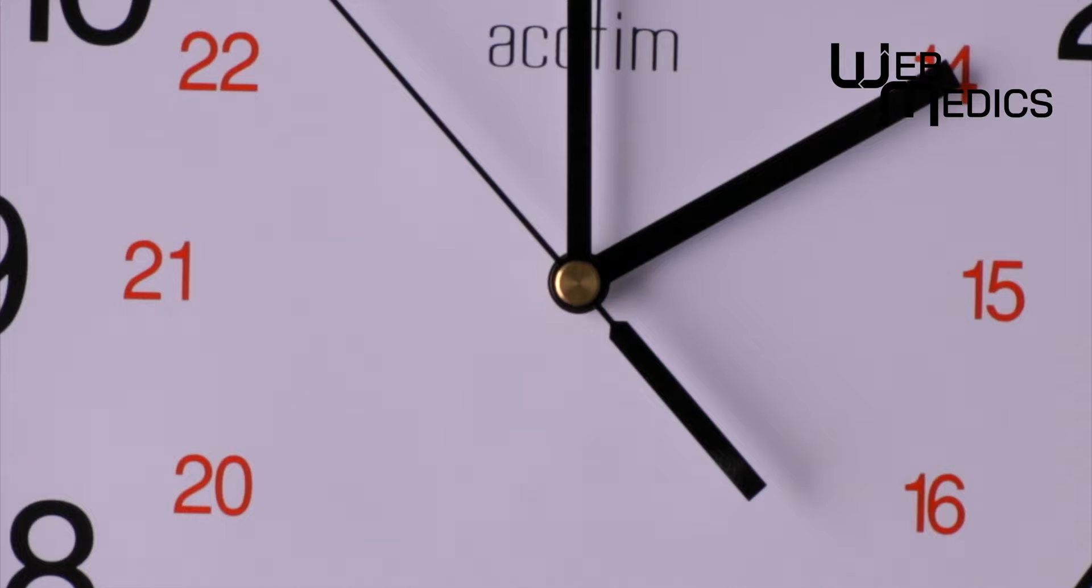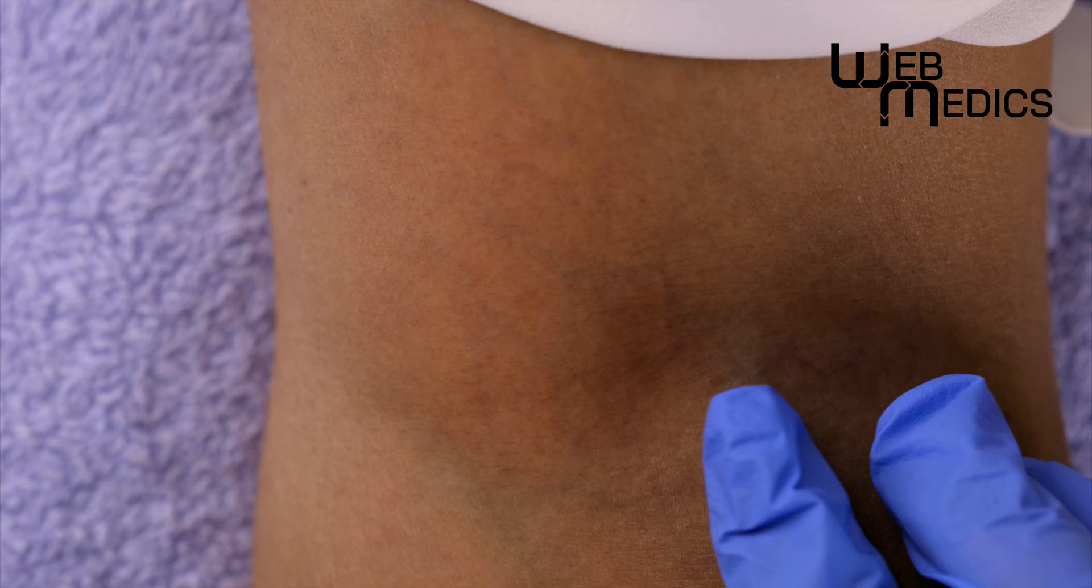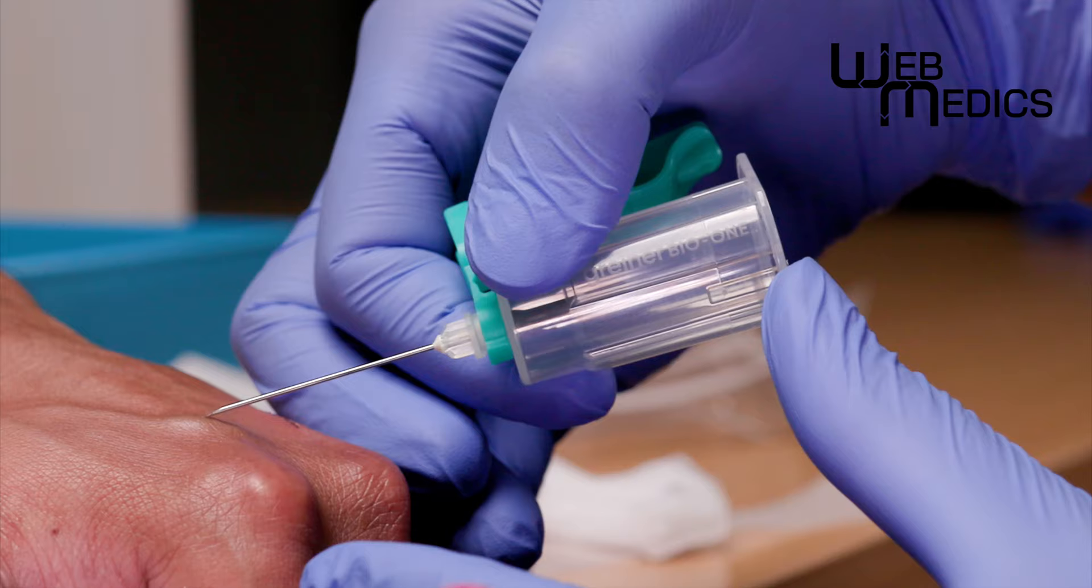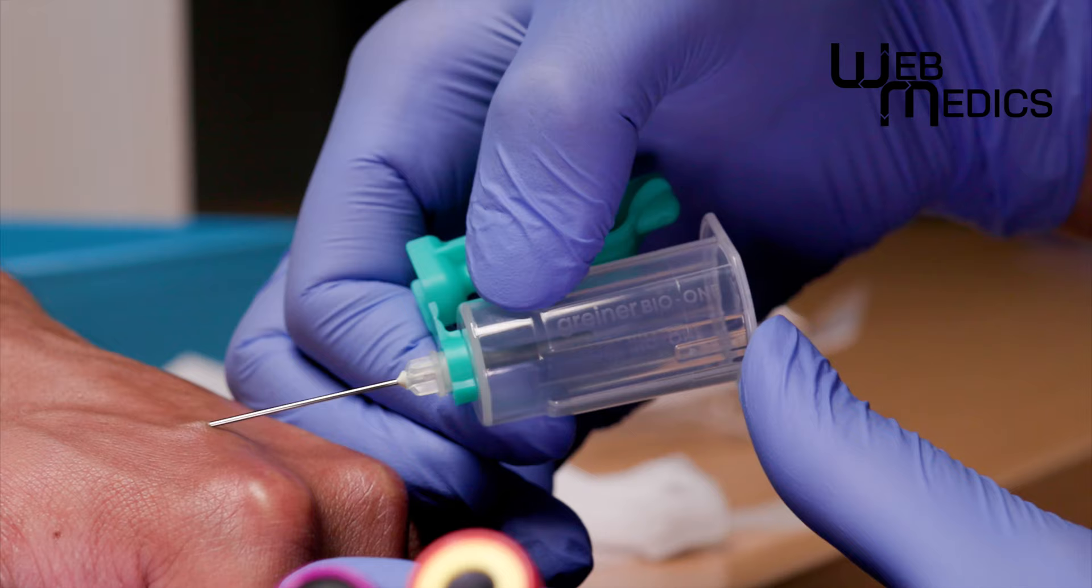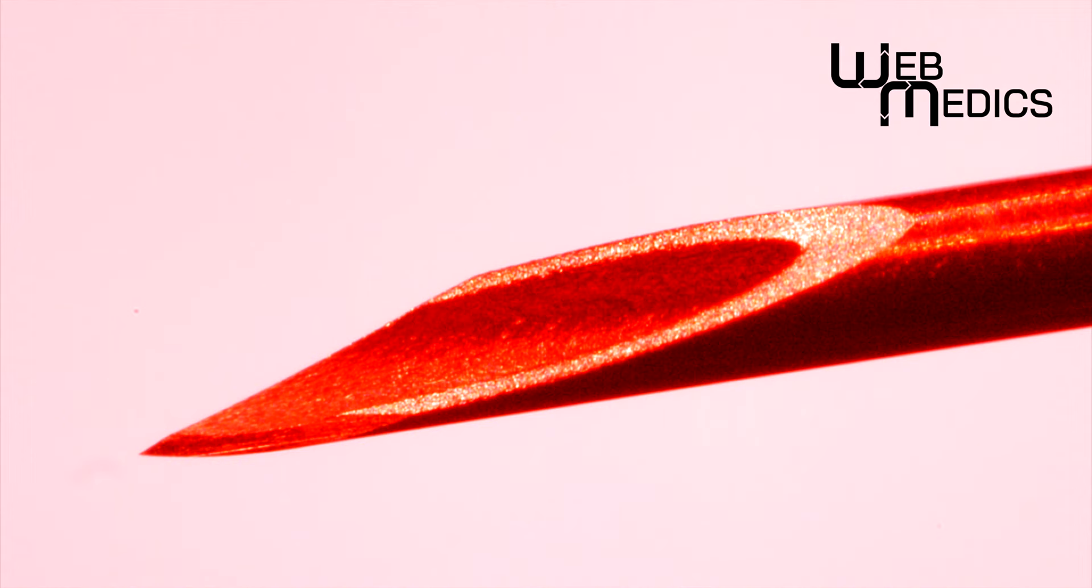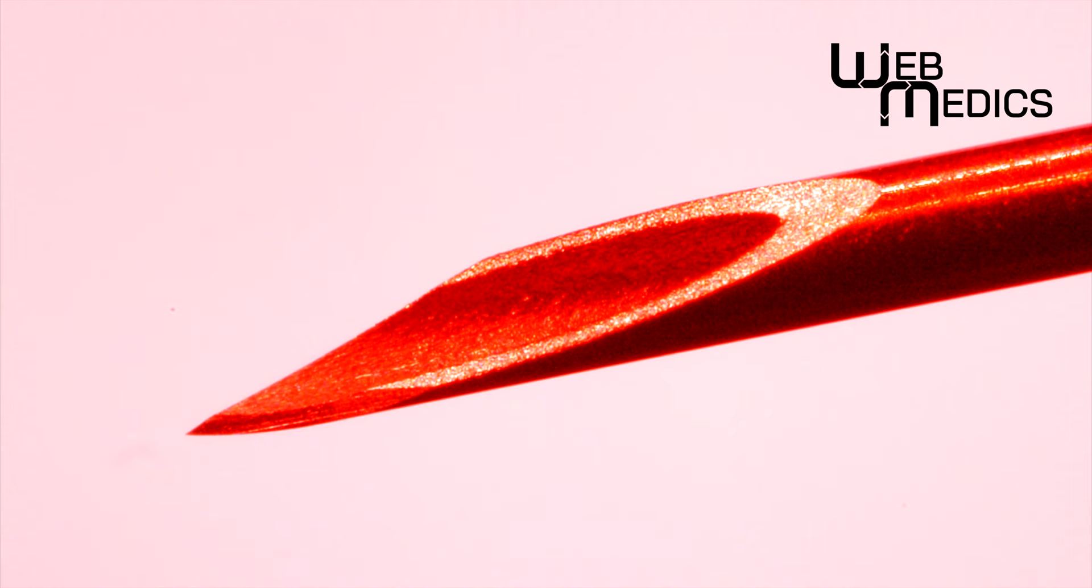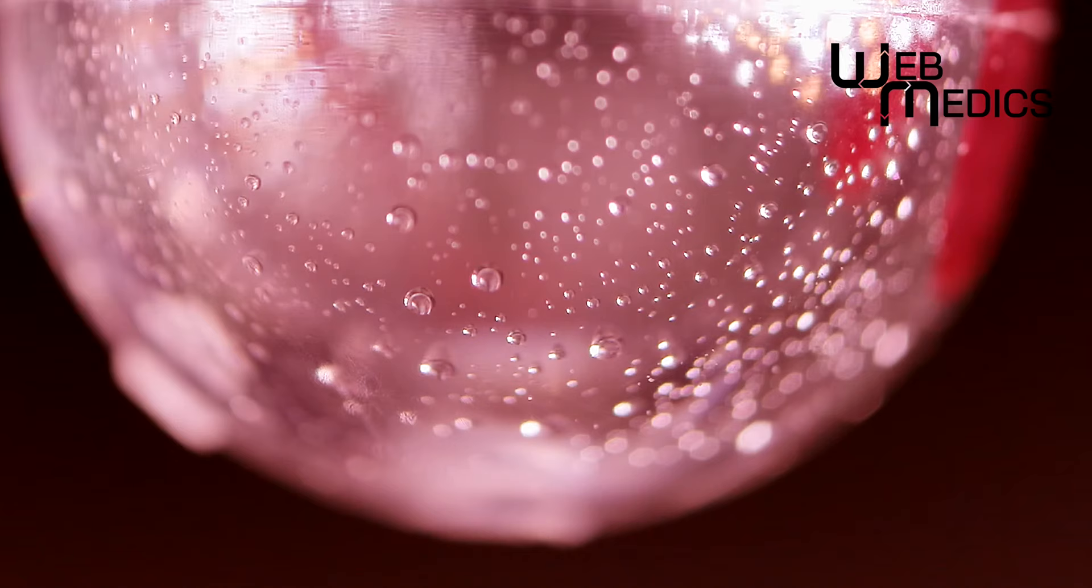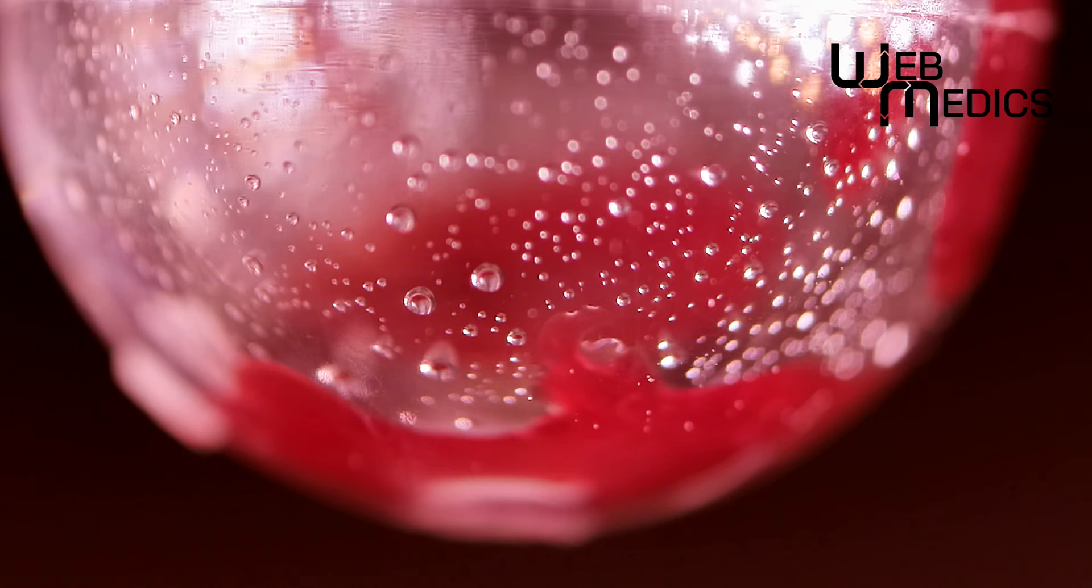But isn't this all just a waste of time? How does position help us find veins easily when they are often buried deep under the skin? How can angle help us draw blood on the first try when some veins are hard, whilst other veins are soft? After all, there is an infinite range of angles between 15 and 25 degrees, so where do we start? How do we actually do the maneuver when there are different needles and styles of holding them? Is a blood test really that important anyway?